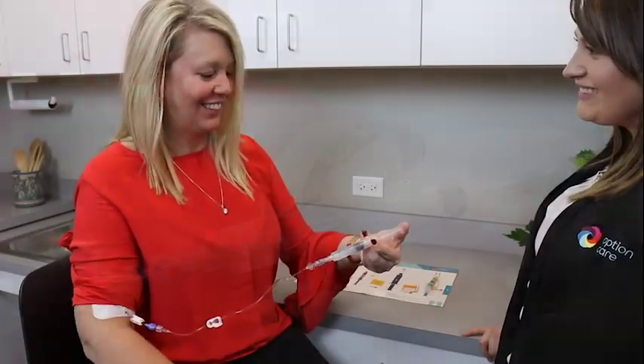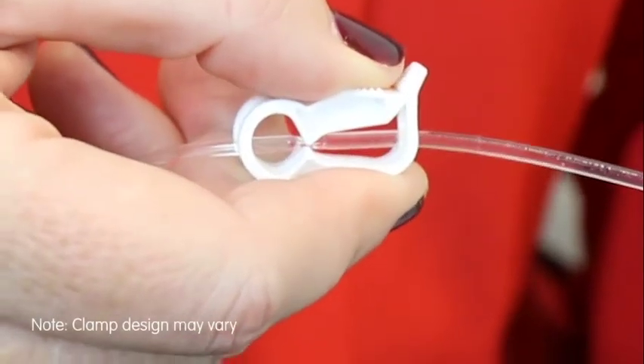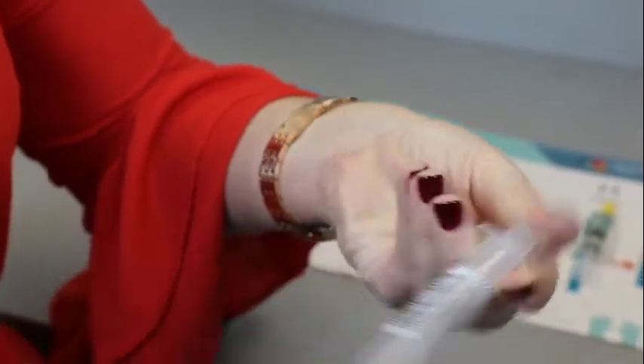Flush your IV catheter using a push-pause method. Close the clamp on your IV catheter and/or extension set unless you have been instructed to flush with heparin. Lastly, remove and discard the saline flush syringe in a trash container.